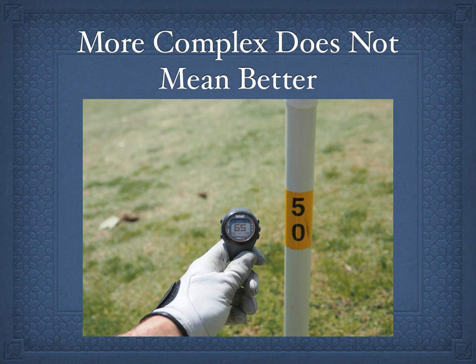And so, particularly in the area of polarization sensitive OCT, we've used it in the joint on cartilage, where the orthopedic surgeons are very happy with the qualitative data, mild, moderate, severe. And the push to have quantitative data, if you're going to push for these complex systems that have a high amount of error, there has to be a reason for it. And you have to say what the unmet need is. Why do you need the exact polarization vector to make the diagnosis, to manage your patients differently? And I've never had anybody actually answer that question.